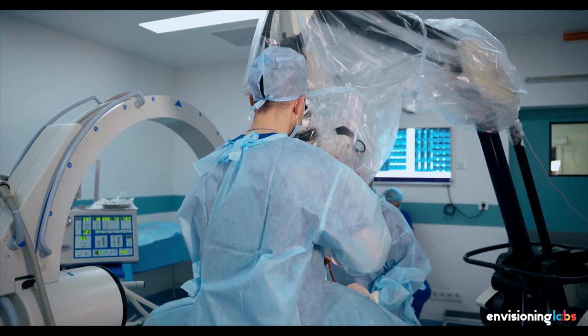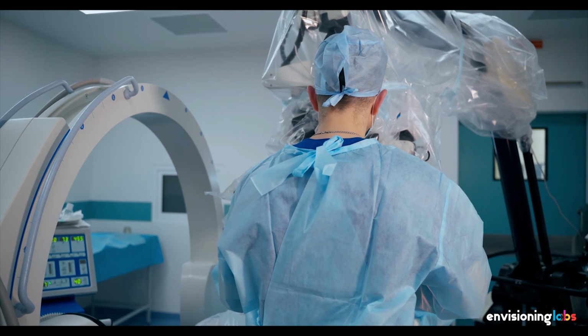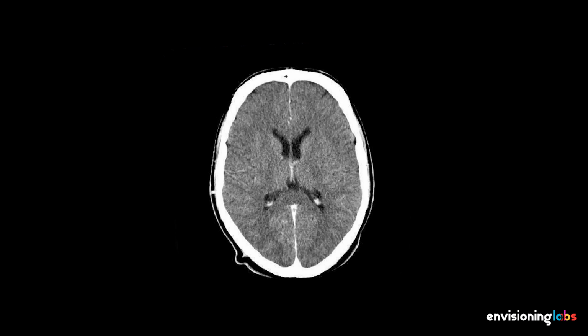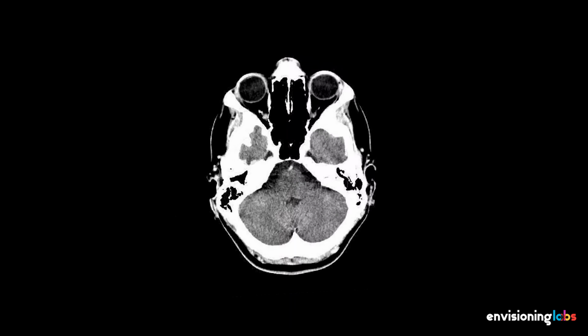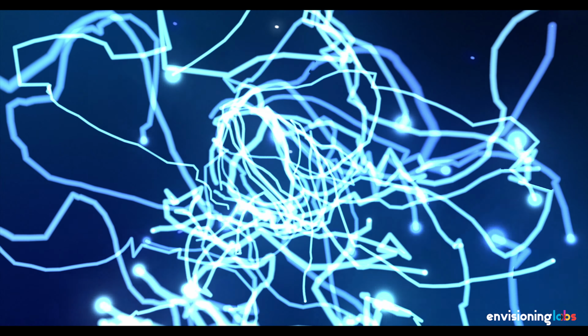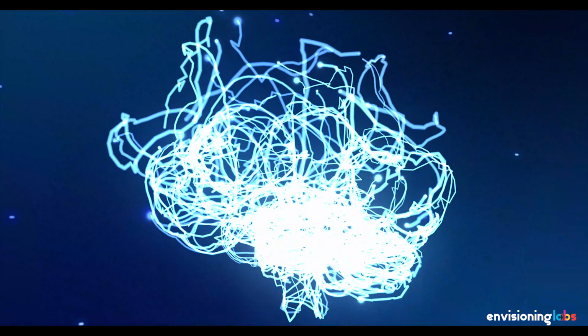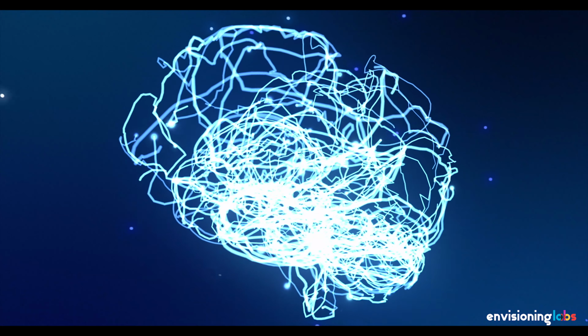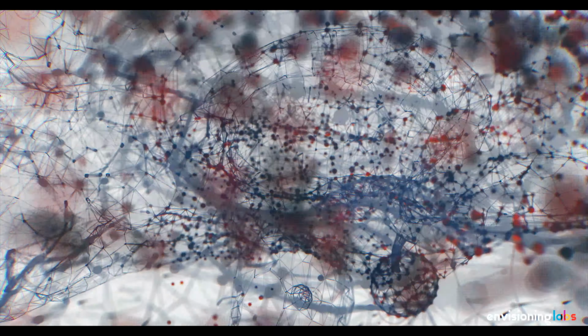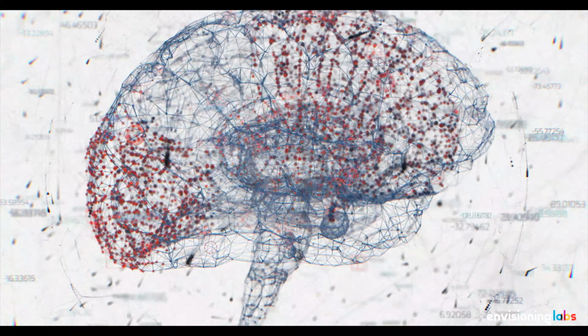Normally, neurosurgeons use microscopes to help them remove brain tumors. However, sometimes they can't see the difference between the brain tissue and the tumor tissue. Envisioning Labs has created a technology that can sense the difference between tumor brain fibers versus regular brain fibers by sensing how light passes through the fibers.